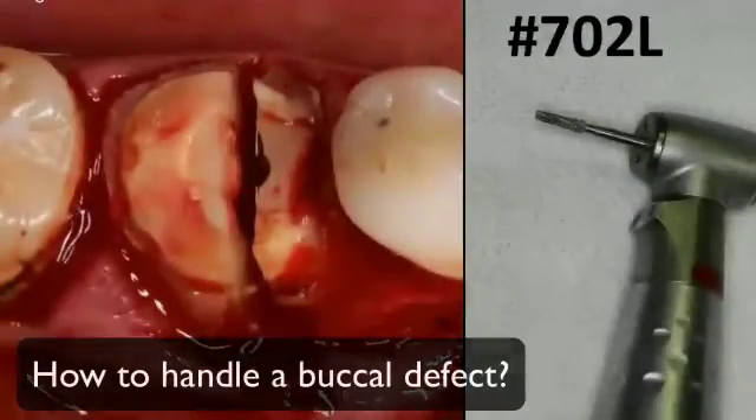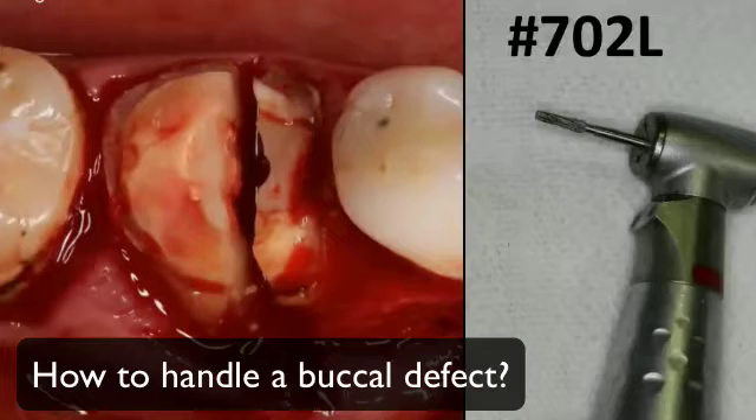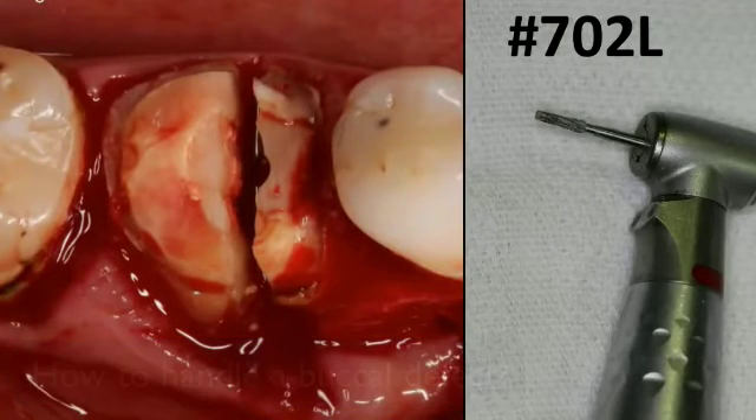Once you have this protocol selected, I personally like to remove the crown first — usually it comes out with just universal forceps. The sectioning is done in a buccal-lingual direction, and I use a 702 long with an electric handpiece, but you can use almost any handpiece. Section the crown portion through the root.